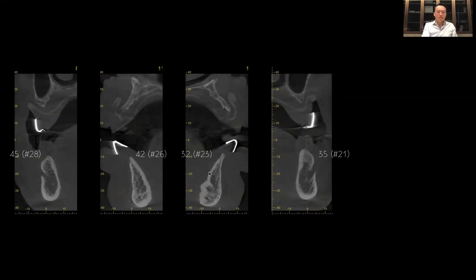And for the mandible, we can see after the healing, this is where I planned the teeth position should be. And we can see the patient has a knife edge ridge now. And there are a couple issues here. First, there's not enough vertical space between my occlusal surface to the top of the crest. So basically, during surgery, the first step that we need to do is some ridge reduction. And then I will need to reduce this ridge first to create, one, enough vertical space, and two, to reach a thicker area at the bottom here so I can place my implants.